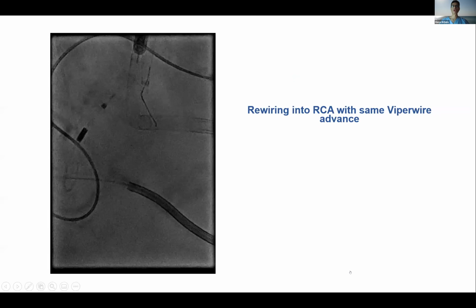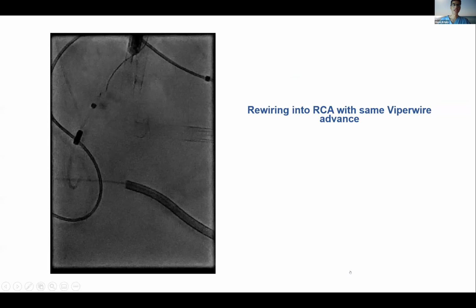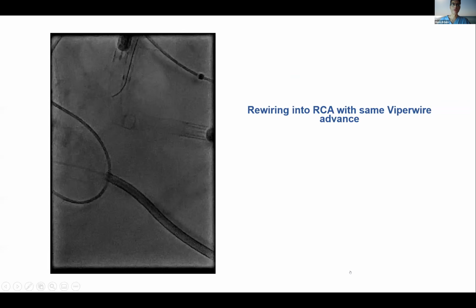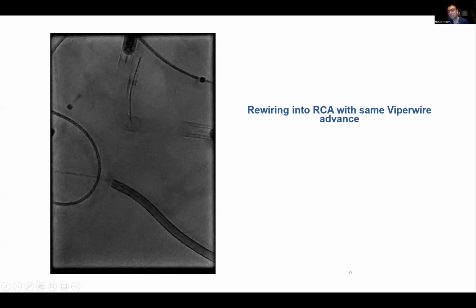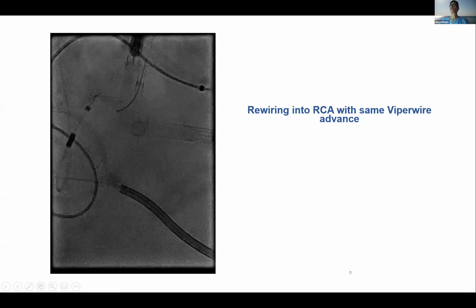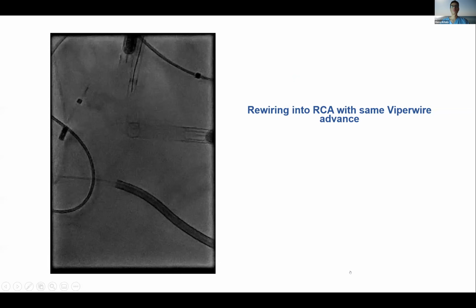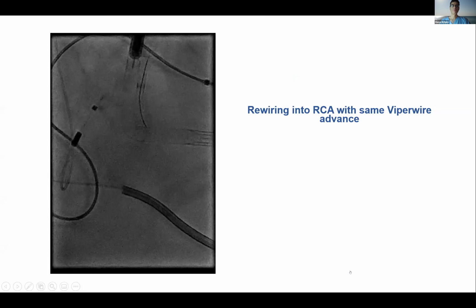So Michael, very good question over here. So obviously here you have a bifurcation, right? And that's critical. It's not just the left main, it's worse than a left main because everything is applied through this. Exactly. And you're atherectomizing right next to the other vessel. So any thoughts about doing something to protect the other branch in case things went south?